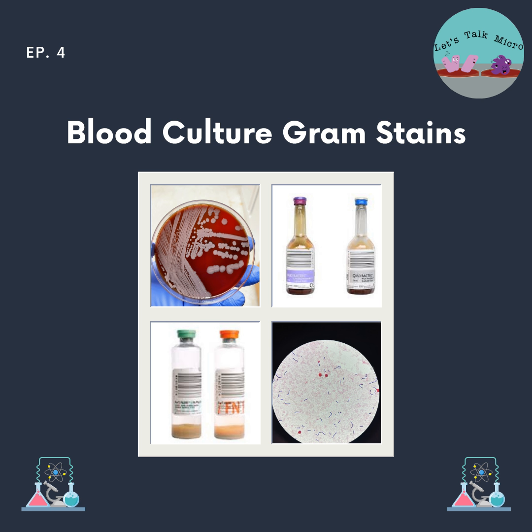And then, you're still going to put it on media, and I'll talk about that in a little bit, but you're not going to report it as NOS or no organism seen. You document it internally, and then you put the bottle back in the incubator, let it be in the automated system. And then, if it's a true positive, later on it will flag again. It will mark it as positive, and then you might be able to see the organism.